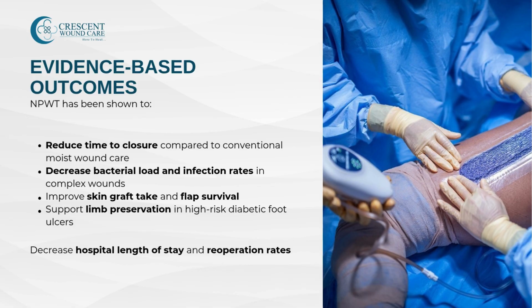Improved skin graft take and flap survival, making it a preferred option post-operatively in plastic and reconstructive procedures. In diabetic foot ulcers, NPWT has been shown to help avoid amputations and preserve limb function. Reduced hospital stay durations and lower reoperation rates, which translates to overall cost savings for healthcare systems. These evidence-based benefits highlight why NPWT is considered a gold standard in complex wound management.